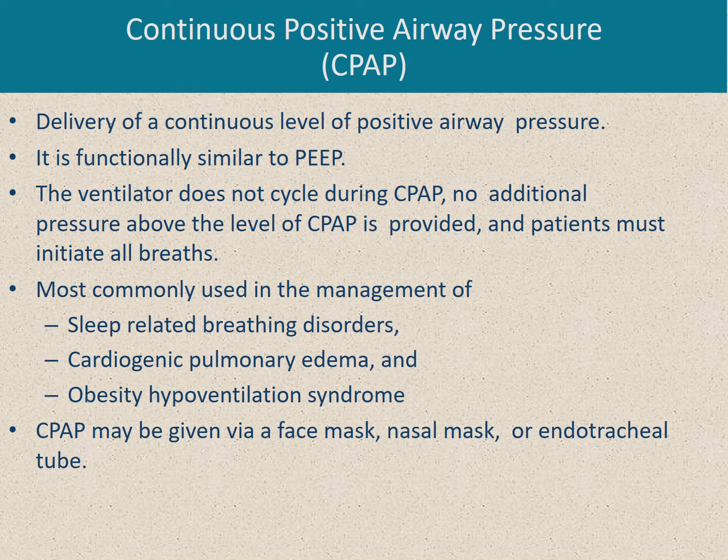Another spontaneous breathing mode is continuous positive airway pressure, or CPAP. CPAP means that the airway pressure never goes back to zero. It functions similar to PEEP. It means delivery of a continuous level of positive airway pressure. The ventilator does not cycle or give any breaths, only allowing the patient to inspire and exhale at a higher baseline airway pressure, which is the CPAP. The patient must initiate all breaths.